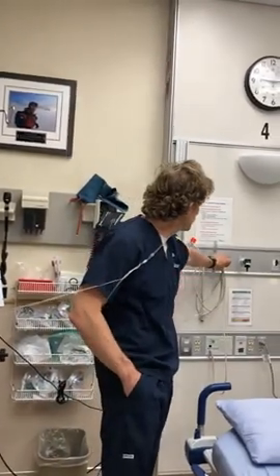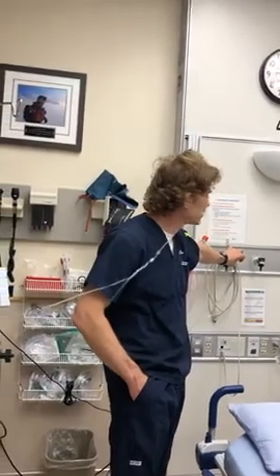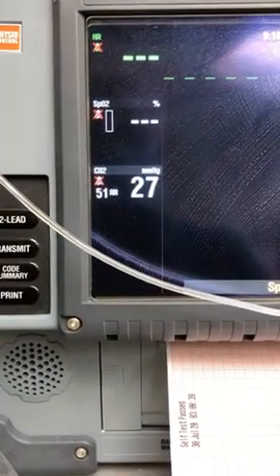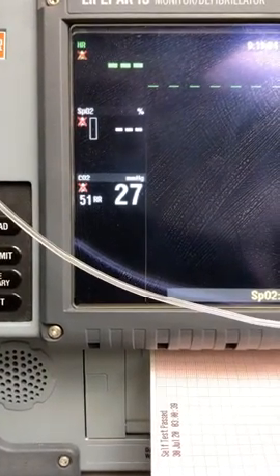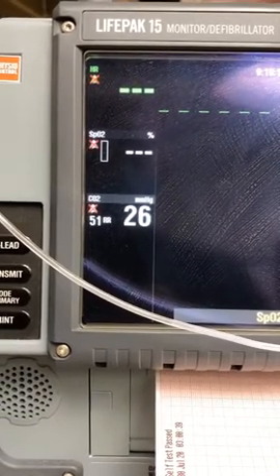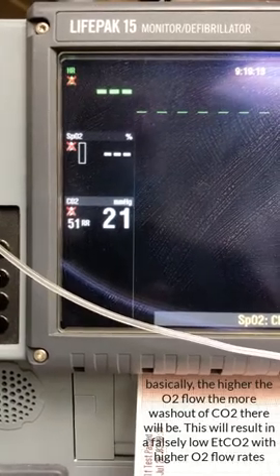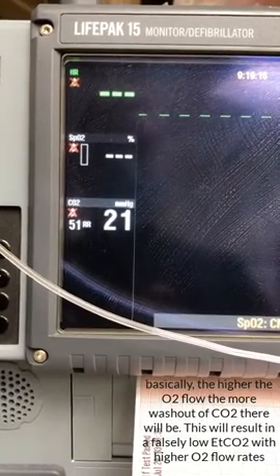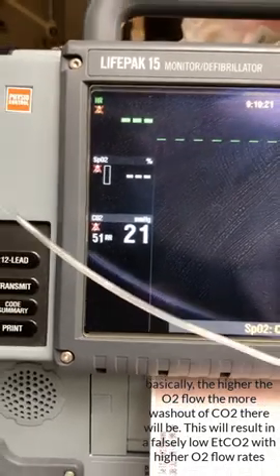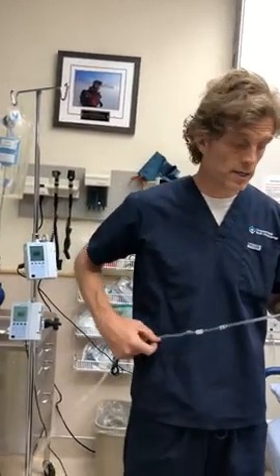Let's just go up higher — we'll go up to 10. You can see it drops quite a bit, and I don't think I've changed my ventilation that much to explain that amount of drop to 21 millimeters of mercury.